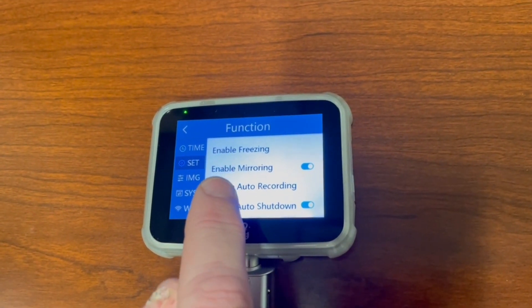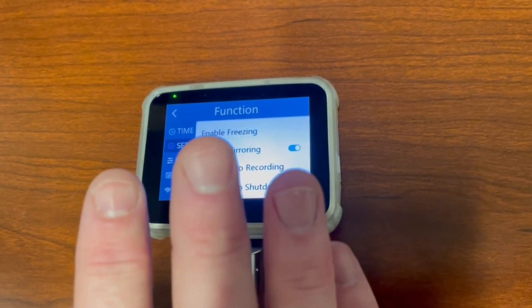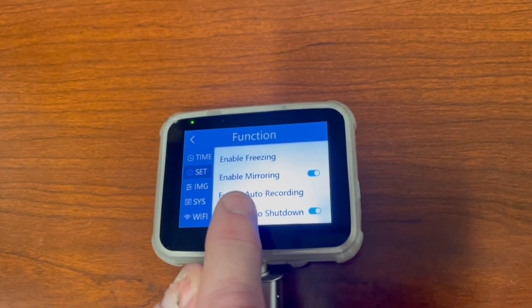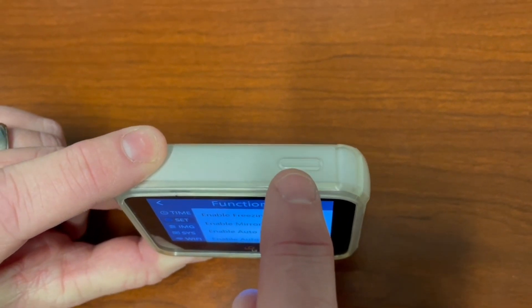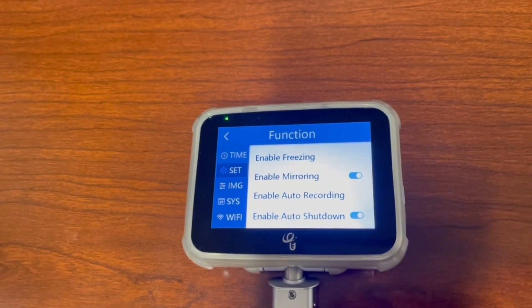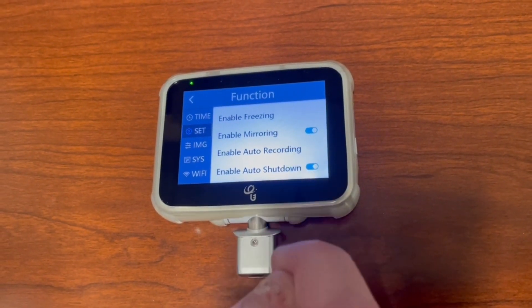Enable freezing: the best way I can describe this is like doing a panoramic shot on your phone — keep this off. If you push the black button to take a picture with freezing on, it continuously pictures, but if you move the scope you won't be able to see what's happening until you push the black button again. Keep enable freezing off. Keep enable mirroring on — when it's on and you're doing a face-to-face intubation, push the on button once and it will flip the screen for you. Keep enable recording off — when it's on, as soon as you put a blade on it starts filming immediately. That's done in the anesthesiology world for video editing; we don't edit our videos, so keep enable recording off.